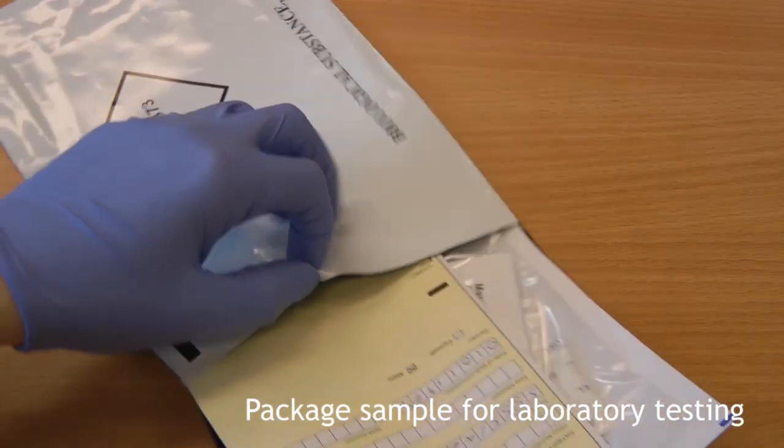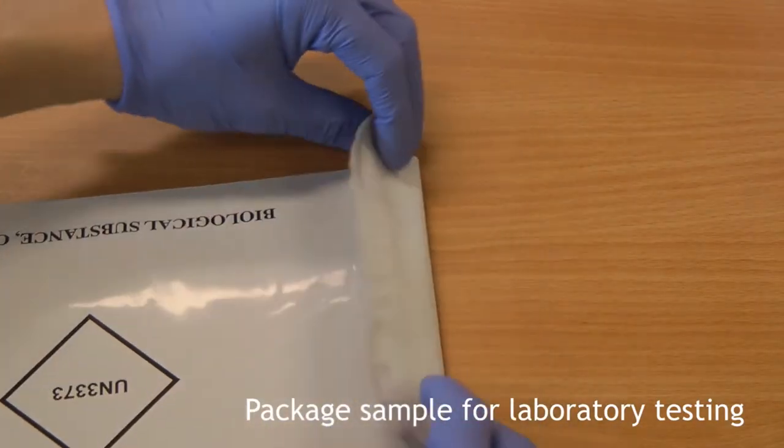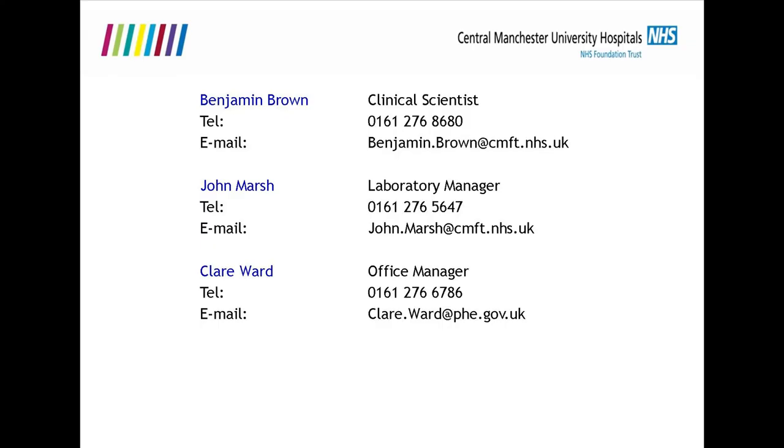Finally, put the completed request form and bag containing your sample into the grey free post envelope. Seal it and post it. Our turnaround time is 1 week from when we receive the sample. There are instructions on the back of the form to help you while you are taking the sample.